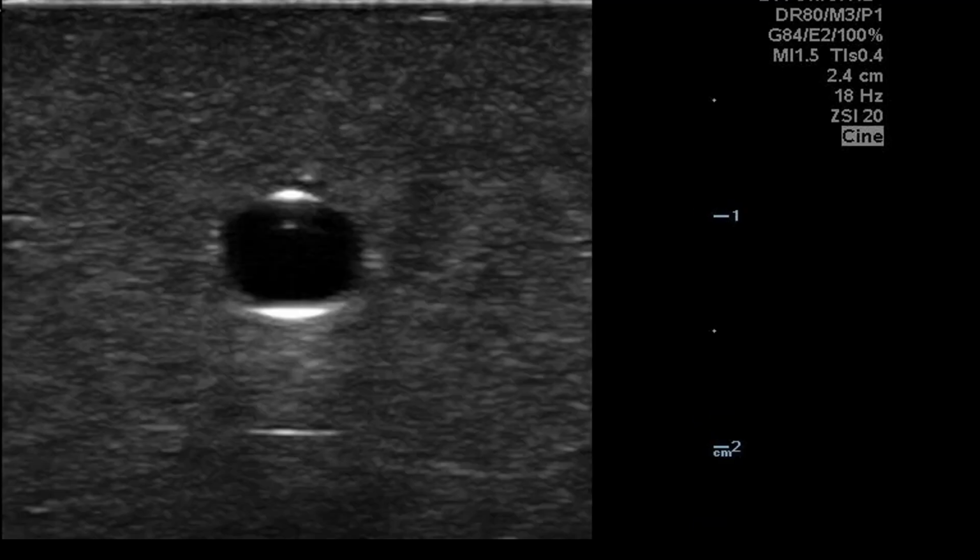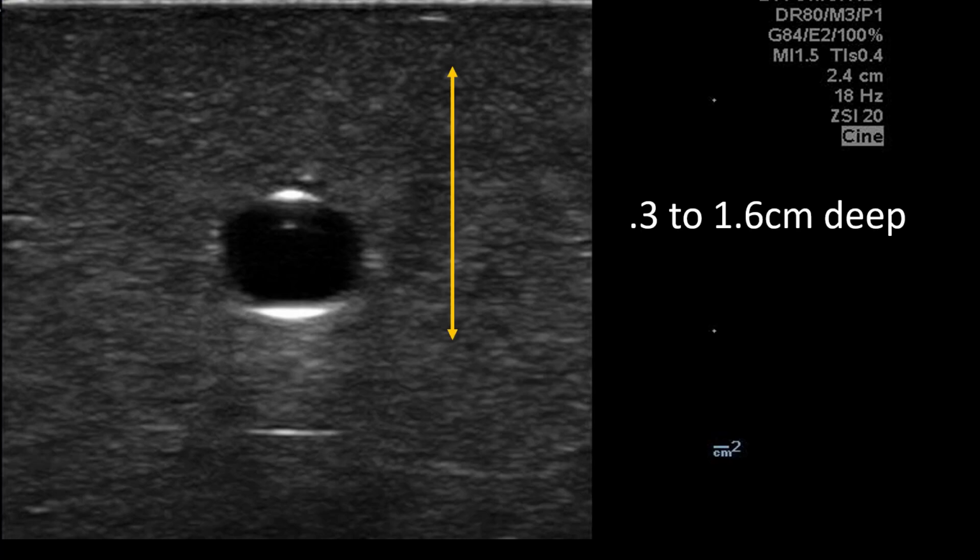If you see a vein at an accessible location on your patient, are there any other characteristics of the vein that you should keep in mind? In fact, the size and depth of the vein in question play an important role in how suitable it may be for cannulation. The available literature suggests that veins located at a depth between 3 and 16 millimeters, and that are greater than 4 millimeters wide, provide the best targets for most operators.